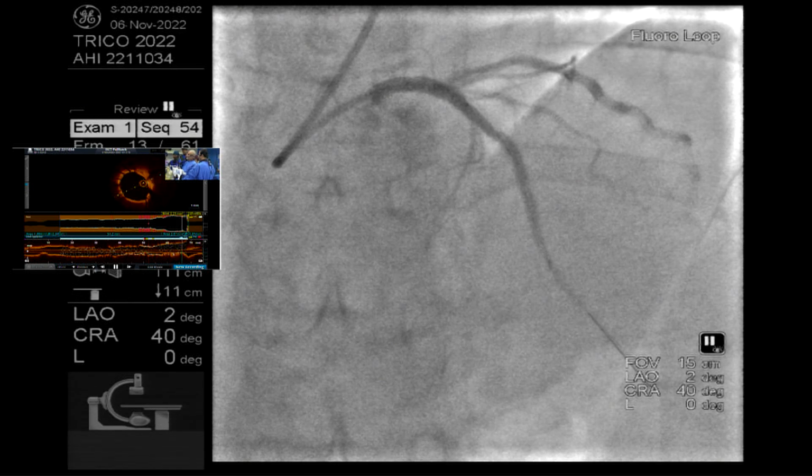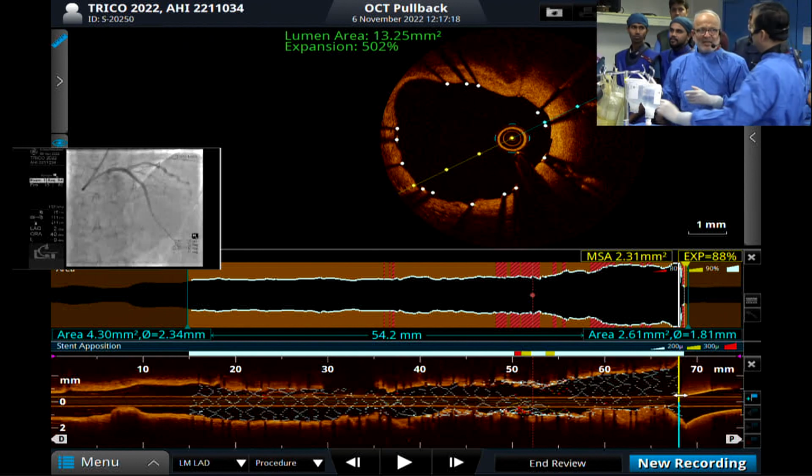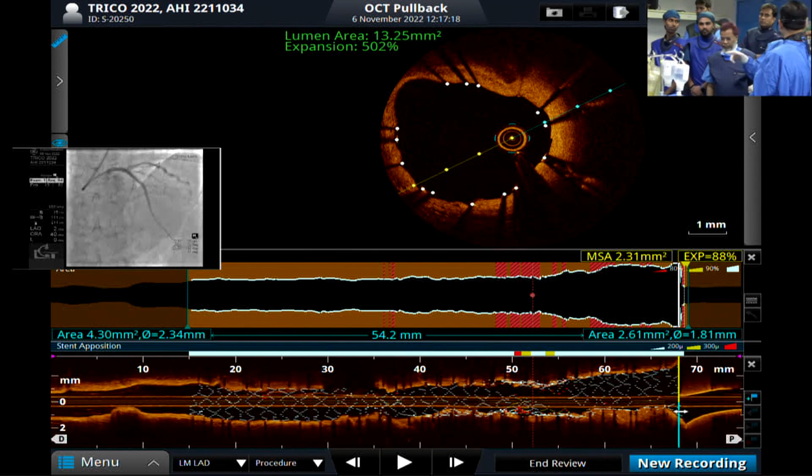You don't think Rota alone can do that? No, it cannot do that, in this situation particularly. Here is the left main. We cannot see the ostium so well. You want to take an IVUS run to see the ostium, which we regularly do. Or we can keep the guide a little out. Yeah, but then the injection will not be good, Sanjay. No, the GuideLiner, no.